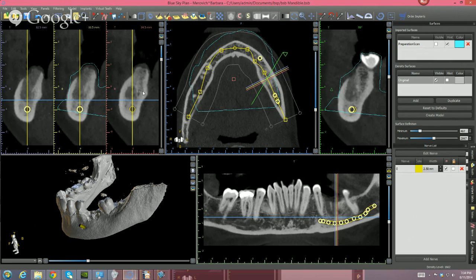Sometimes, not always, the bone is so dense that the drill's not going to be able to do it. We happen to use direct cut drills, which are extraordinarily sharp, but still these are not drill presses. There can be some deflection under the circumstances. So that's important to be aware of.